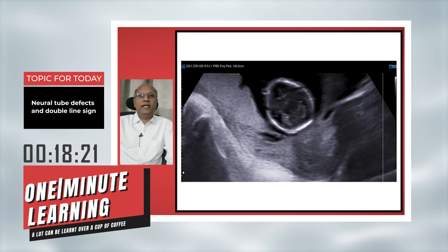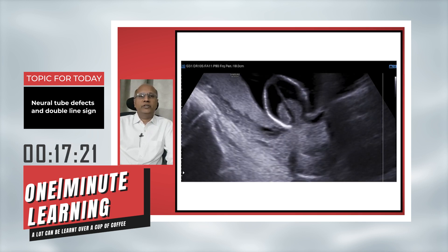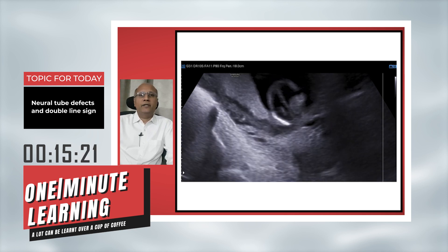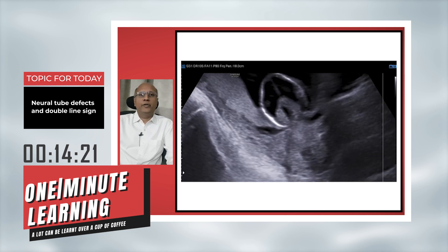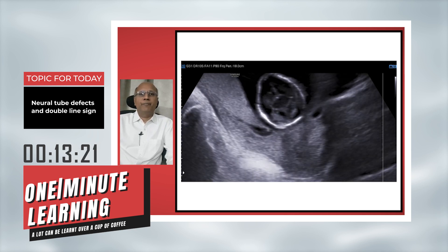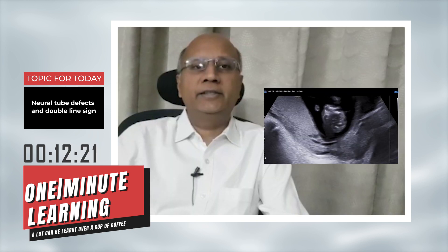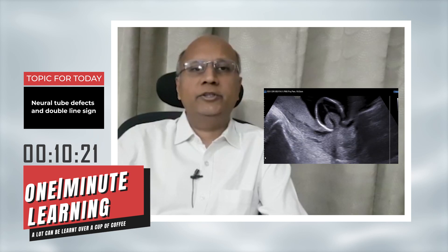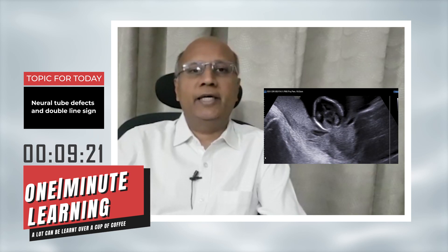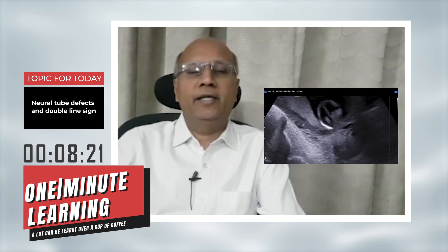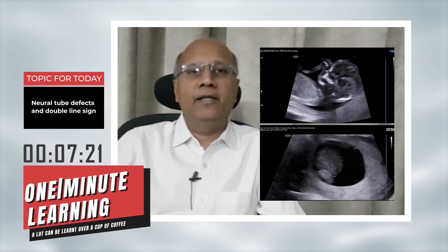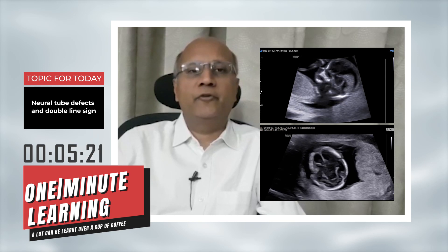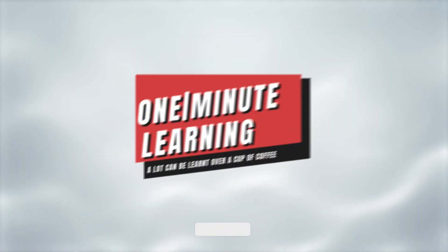This is an axial scan showing loss of the two-line sign and a single line, and this is a strong marker for open neural tube defect.